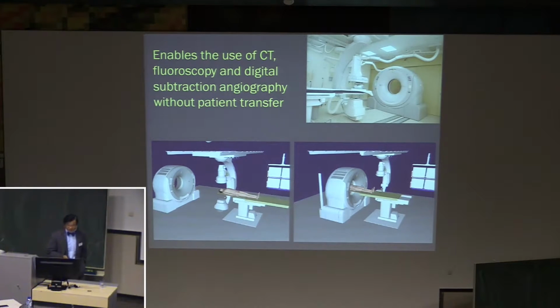This is the concept of the use of a hybrid CT and angiography unit. You can see that the gantry is on rails, so there's no need to transfer the patient from the angiography mode to the CT mode.